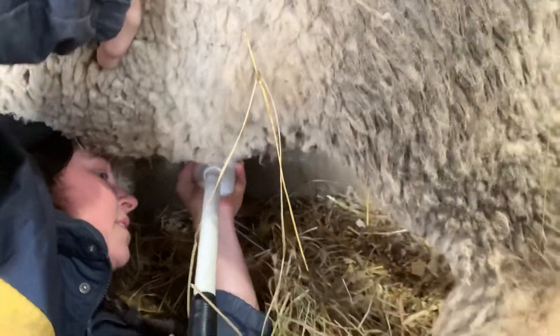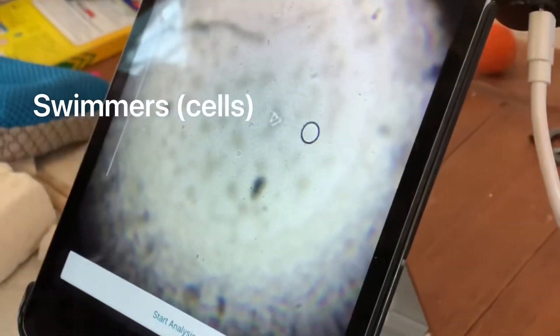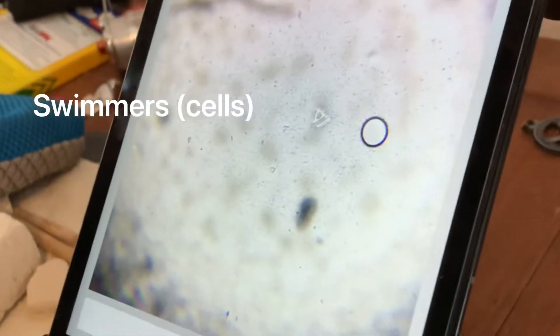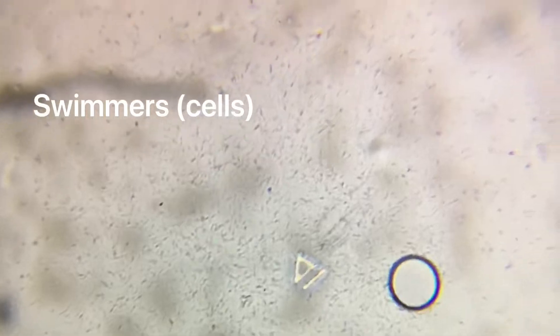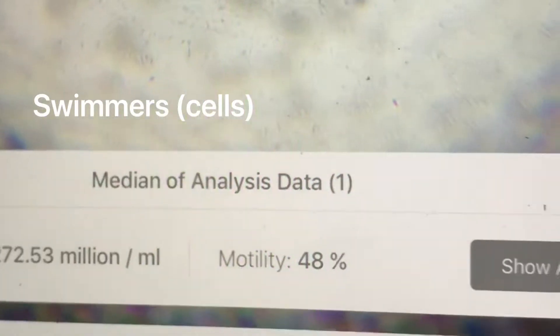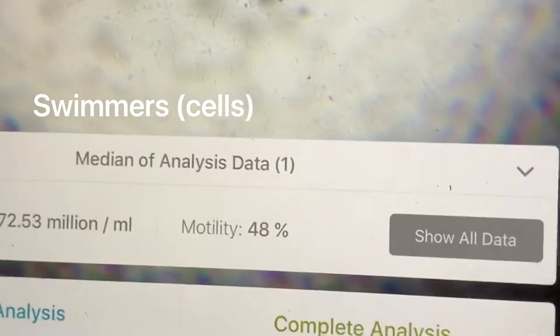Is that enough? This is the iPad that we can check the motility on. That is all of the semen that I showed you before — all the swimmers. That's how they swim up. The motility says 48, so that means 48 percent — almost half of it is good. Those were the swimmers, the cells. It's pretty decent.